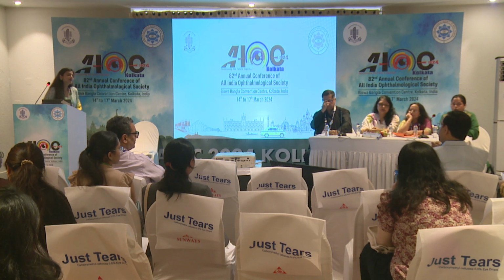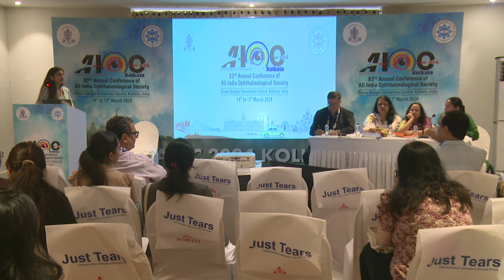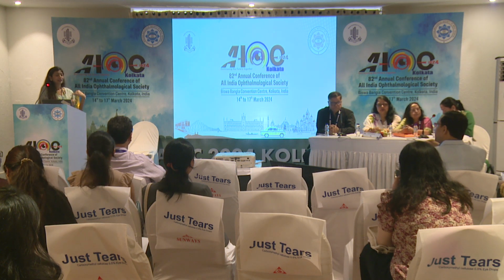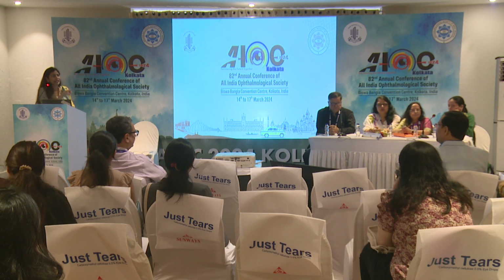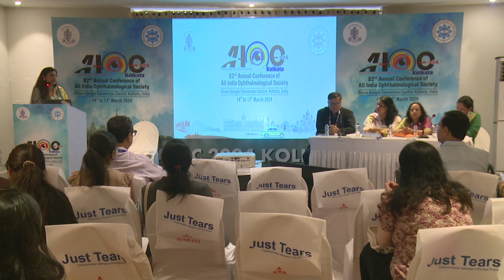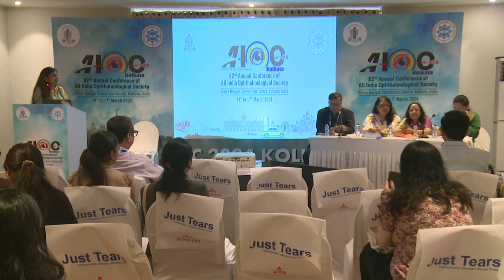Is there any chance that the dialer tip may rupture the capsule margin? When you are pushing the iris, the dialer tip is like this and it is 0.9. Correct, 0.9 is quite big. Is there any chance that it will rupture? It might, obviously, but we didn't face it. You have to be a little careful while using it because it's slightly longer than the normal dialer tip. There is definitely a chance, but if you do it safely, it doesn't really rupture the anterior capsule. Complications can always occur.